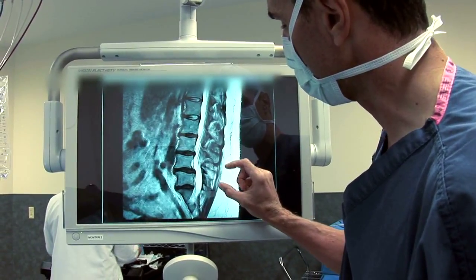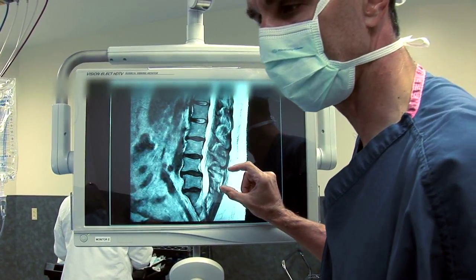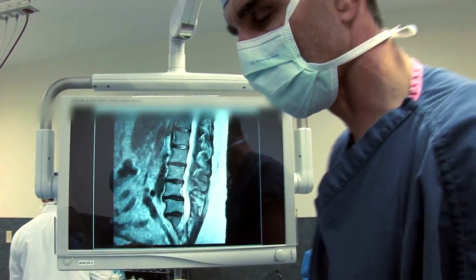Then we're going to go posteriorly and connect the spinous processes together with a tension band called an interspinous device. We'll show you how we do that today.